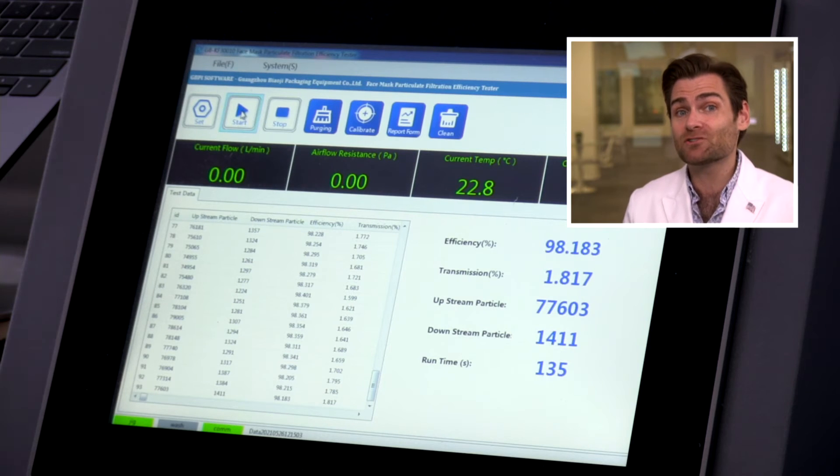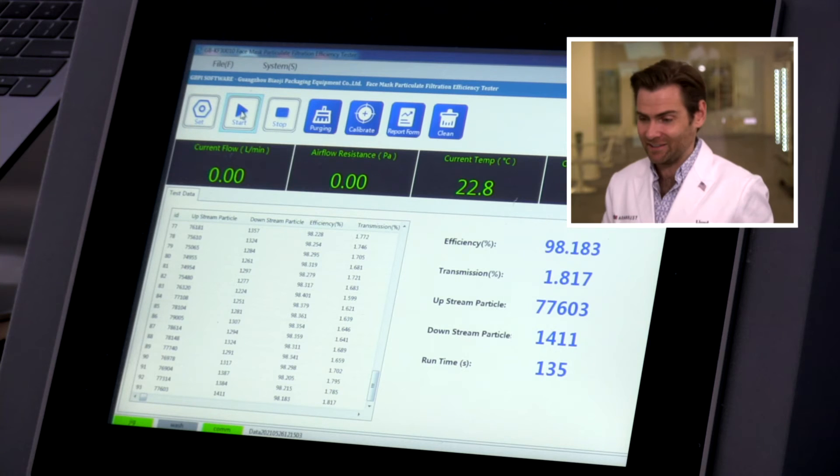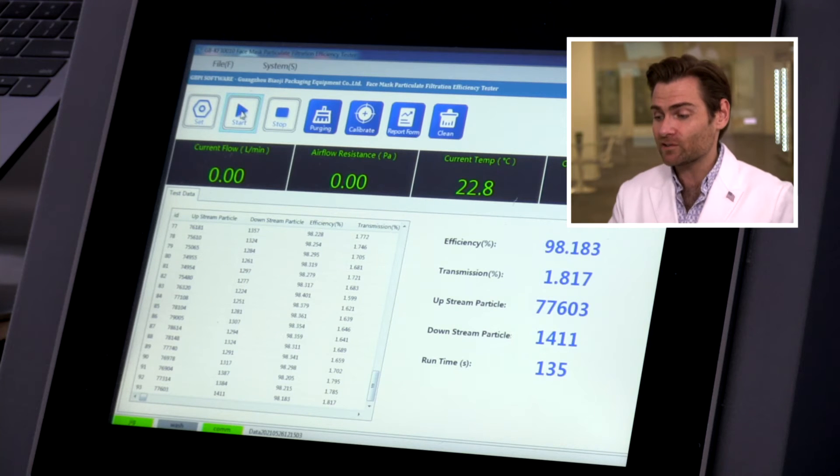Maybe that's why they pulled the surgical mask out and only started putting the HOM masks in. 98.183% — 98.183%. It's a great mask, can't deny it. Looking at the breathability though, I'm actually a little concerned.